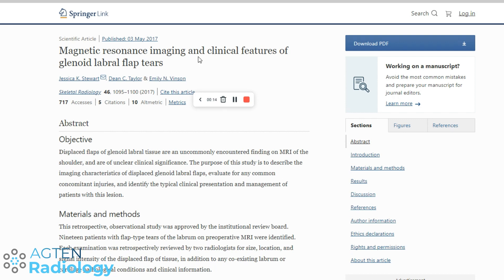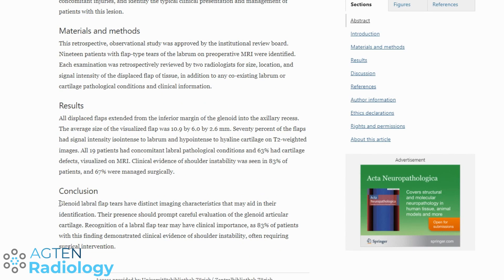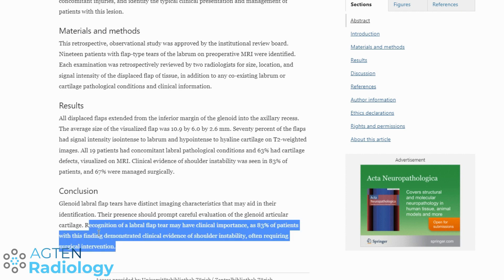Let's look at what they call it: glenoid labral flap tears — basically the same nomenclature as in meniscus pathology. The conclusion states glenoid labral flap tears have distinct imaging characteristics that may aid in their identification. Their presence should prompt careful evaluation for glenoid articular cartilage defects, because it's not just the labrum that's been flipped over — there's also delamination and tearing at the chondrolabral junction. These injuries have a high instability risk and often need surgical intervention.